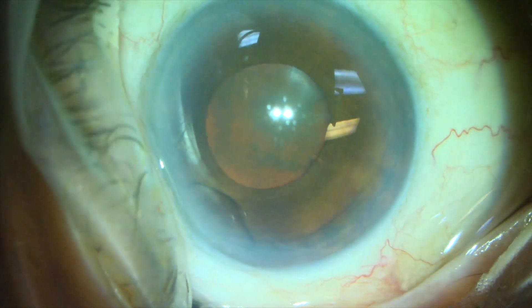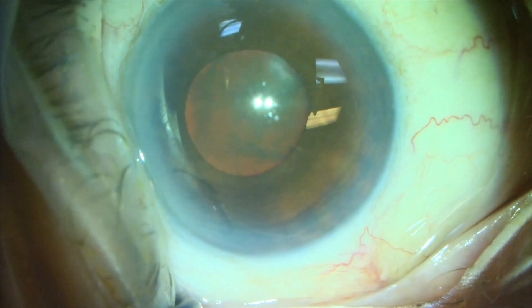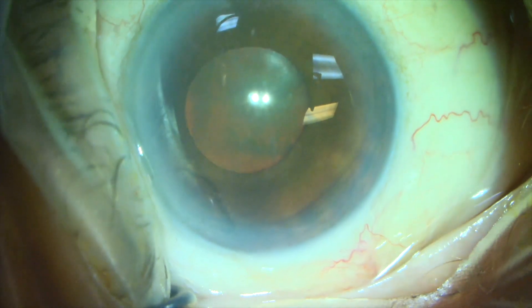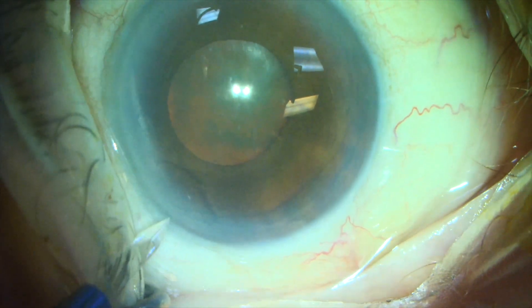This is a 4-plus dense brunescent brown root beer cataract in an 89-year-old patient. Her best corrected vision is count fingers at two feet. As you can see, her pupil does not dilate well, so we place some iris retractors.